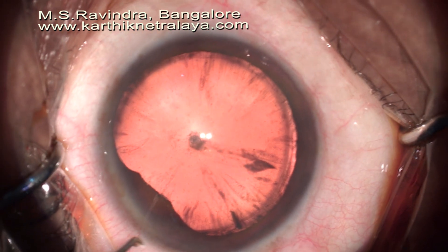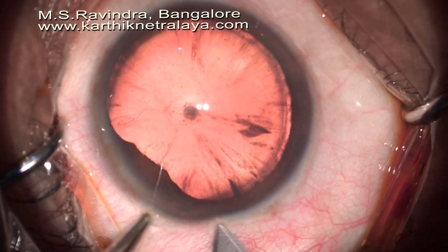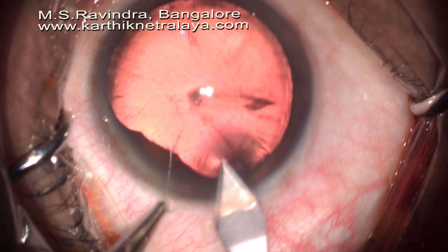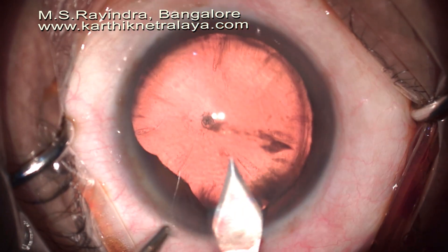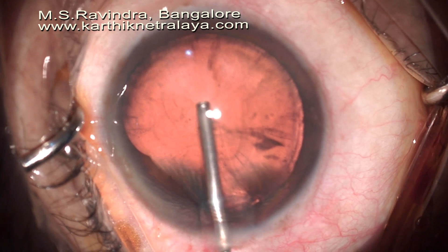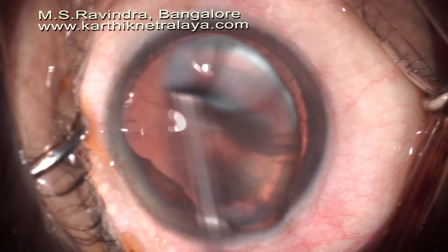An elderly lady presented with a history of trauma to the eye with a ball, which needed treatment for about two months with topical medications about a year ago, with signs of posterior synechiae, signs of inflammation and phacodonesis, indicating a possible tear in the zonules somewhere around the cataract.